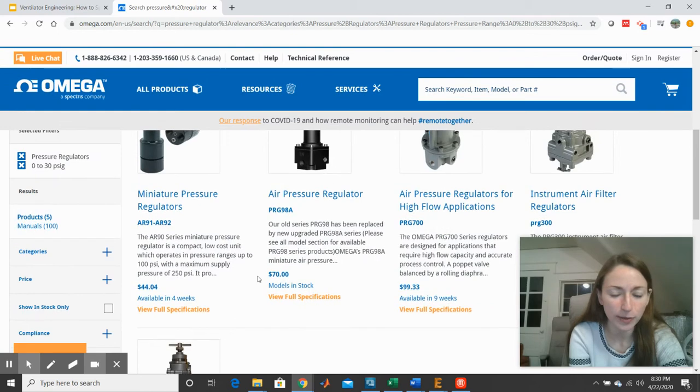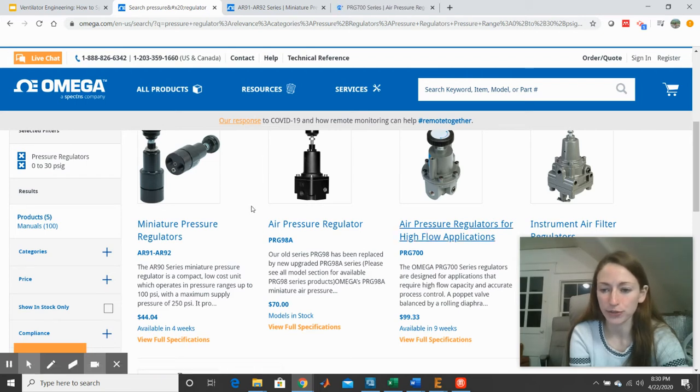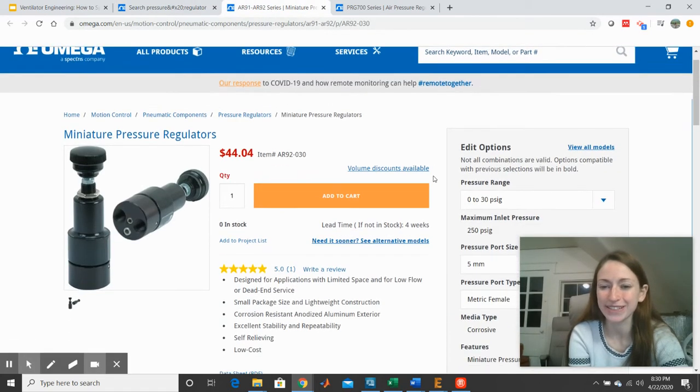I'll look into that a little more closely later, although it is quite expensive. But just to quickly run through some of these, I'm going to compare the miniature pressure regulators to the high flow pressure regulators. Okay. So let's start with the miniature one. I assume that this one will not work, and we'll see if that's true.